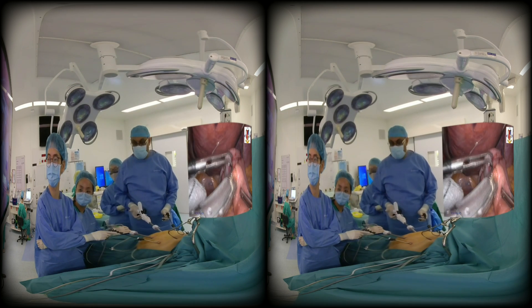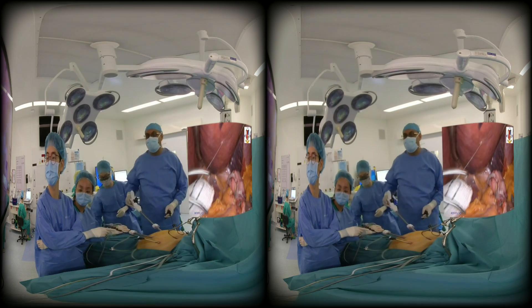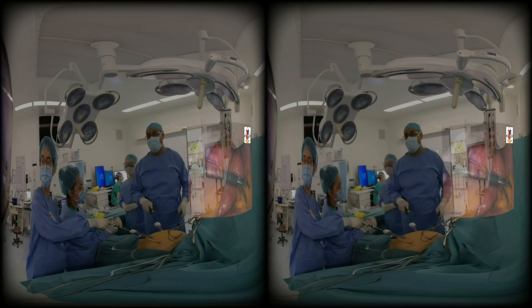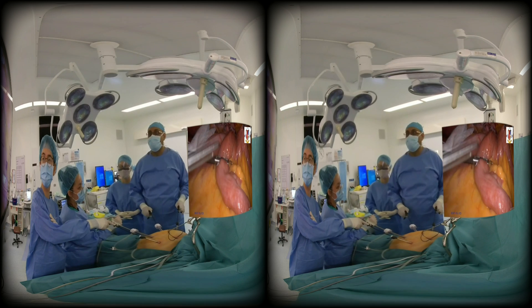We fire the stapler there. Because once we suture, we will suture it tight, and you will have an anastomotic opening of about 1.5 centimeters. Next, we are going to separate the biliopancreatic limb from the alimentary limb.